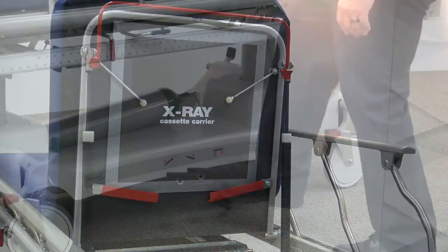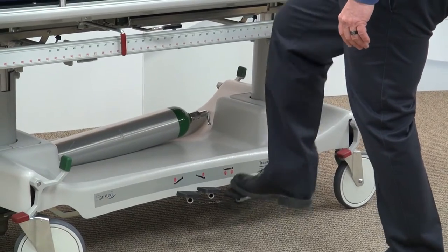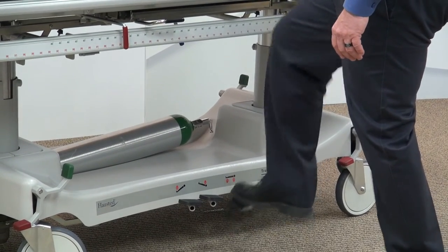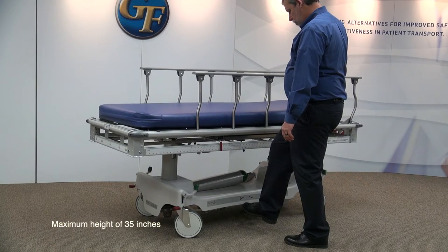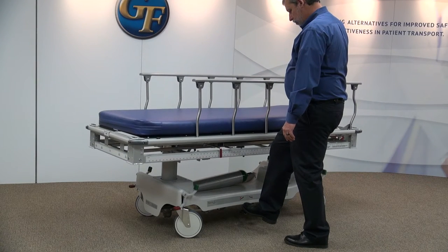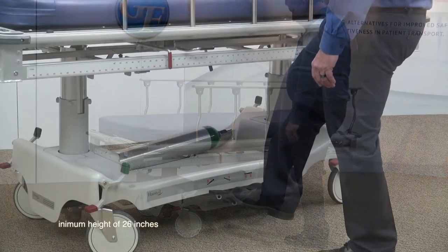The stretcher can be adjusted in its overall height by using the pedals located on either side. The large pedal is used for raising the stretcher top to a maximum of 35 inches. The two small pedals pressed at the same time will lower the top to a low height of 26 inches, allowing for easy patient transfers.